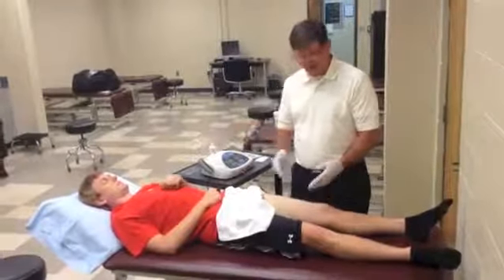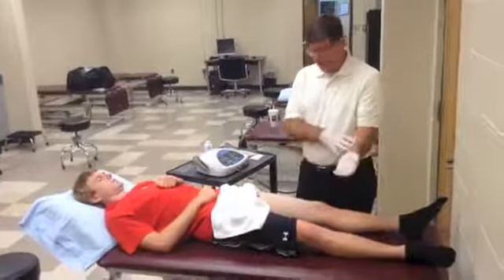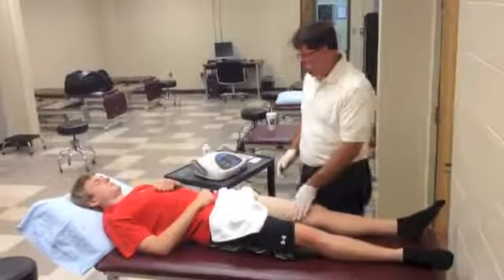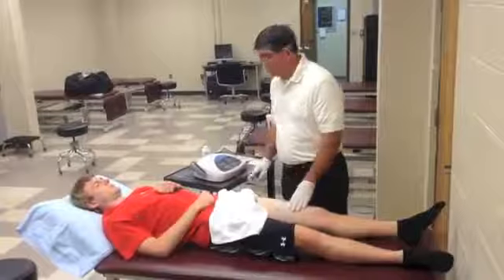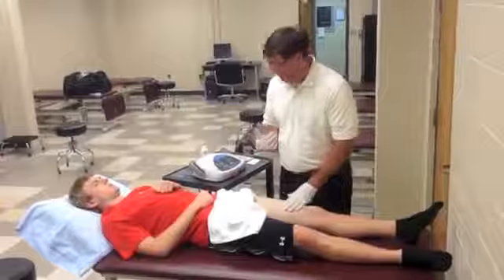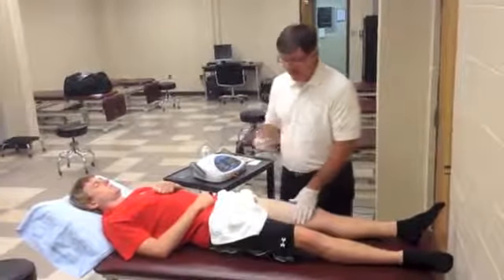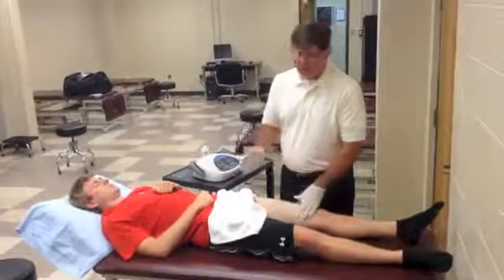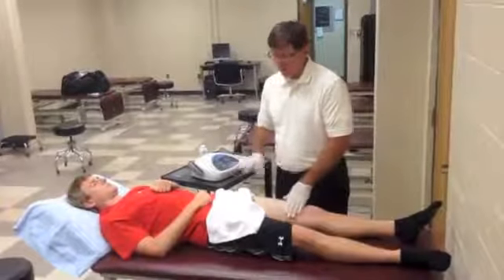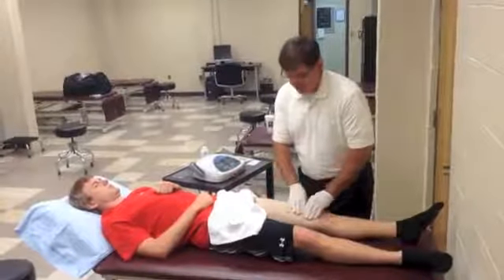The patient's holding a ground mass, and I'm connected to the circuit through this electrode on my arm, but I'm wearing non-conductive gloves. What we're going to do is bring the two circuits close together. And as we do it, and they're alternating very rapidly, what will happen is when I'm negative, I will attract positive ions in the patient, and when I'm positive, I will push away those positive charges, and what we get is an oscillation in the tissue.